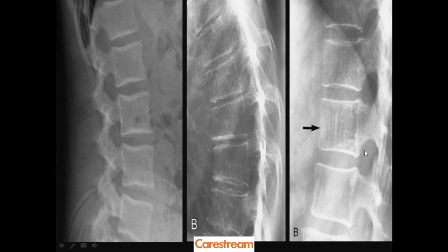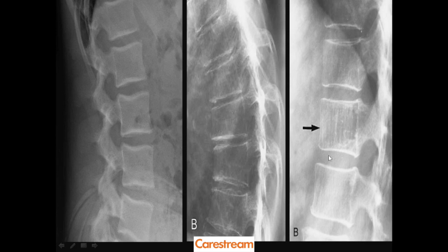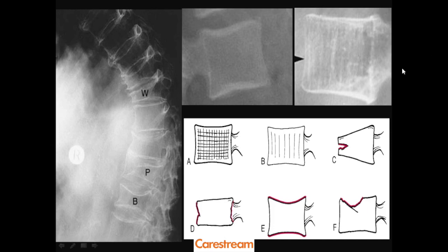The four important radiographic findings in an osteoporotic patient are: increased lucency of bone indicating reduced bone mass; pencil thinning of the cortex; preferential resorption of the horizontal trabeculae, causing the vertical trabeculae to stand out producing vertical striations; and later on, fracture deformity. Let us now see the variety of pictures seen in an osteoporotic spine.